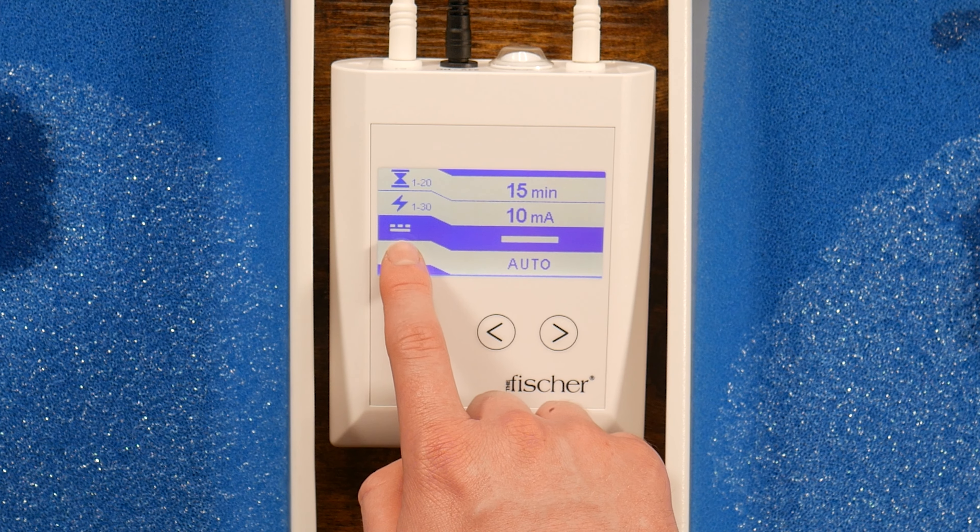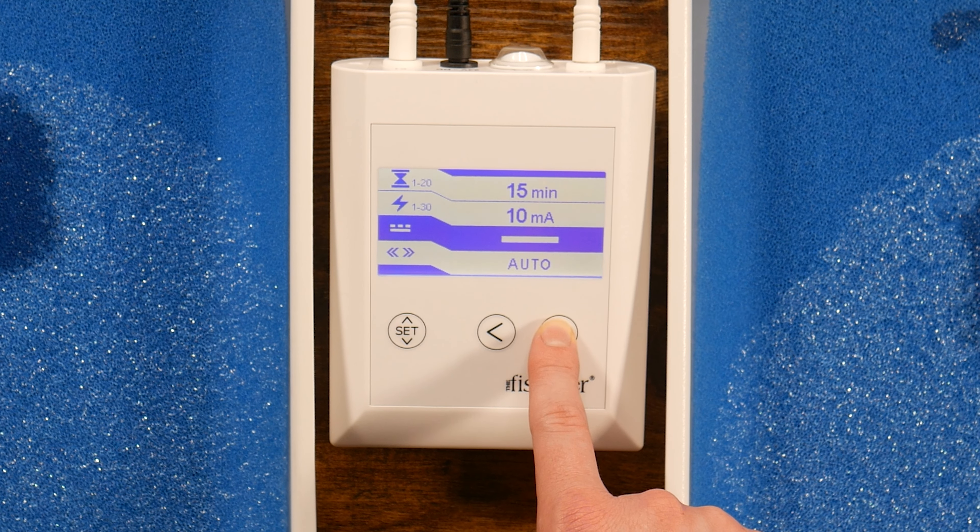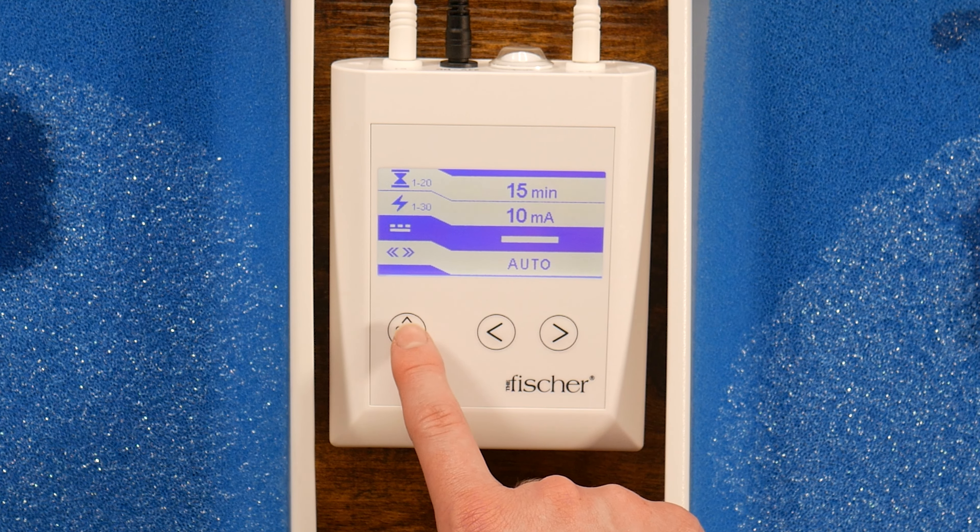Next, you can adjust the current to be either pulsed or direct, depending on what you find most comfortable. Direct current, however, is the most effective. Then, press the Set button again.